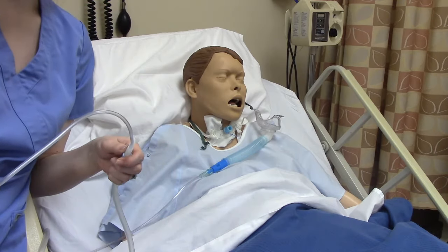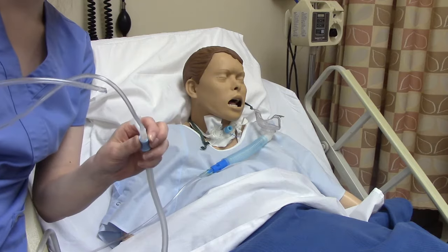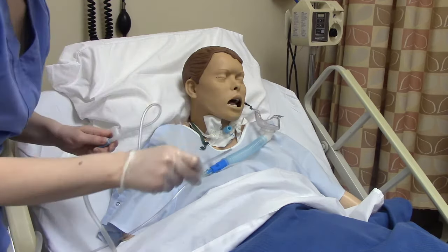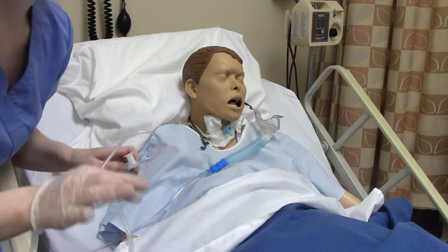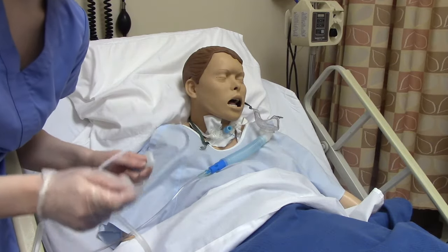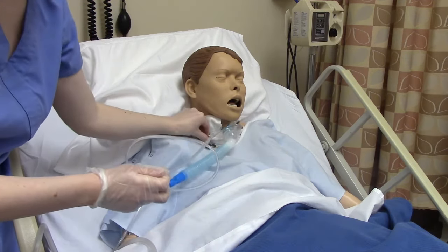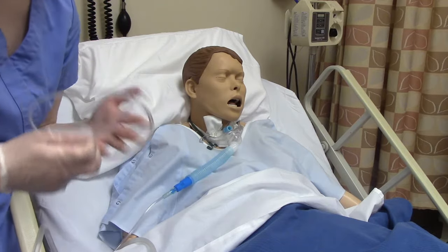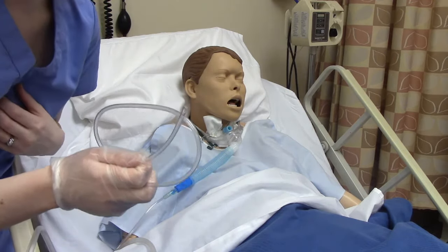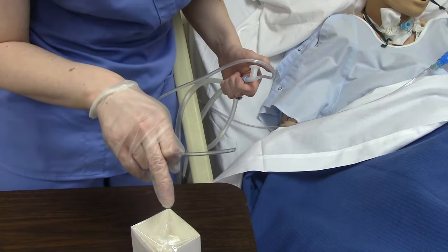We're trying to keep this sterile. This is technically a one-time use item, so once we're done we get rid of it, but we can go down a total of three times in one suctioning session. You don't want to exceed that because this is a lot for the patient — just the work of breathing is taking a lot out of them, and we don't want to overwhelm them or make them feel fatigued. After the third time, you're done.